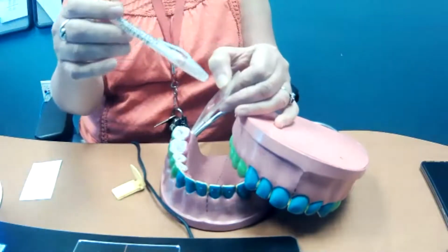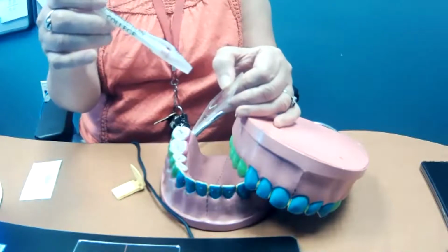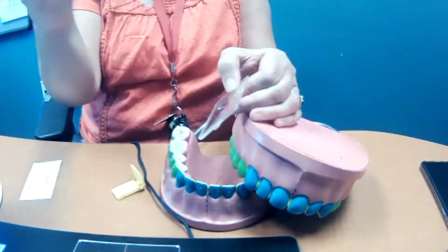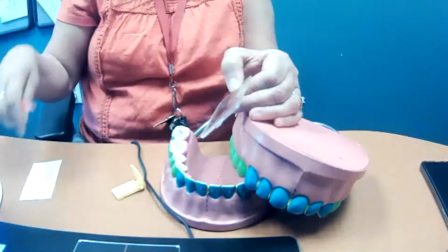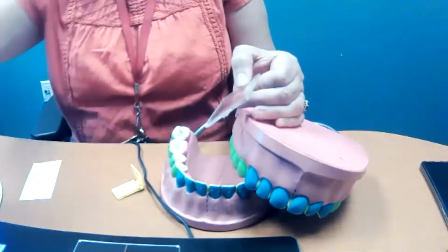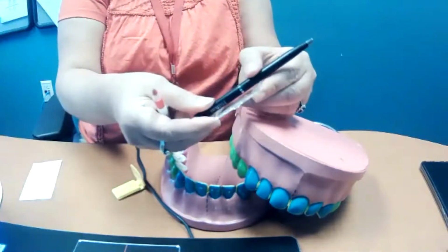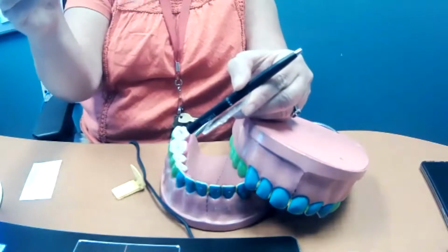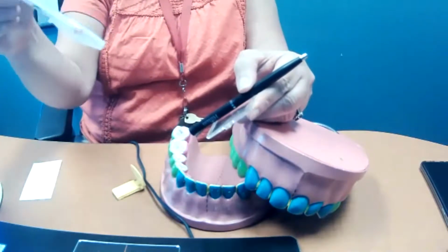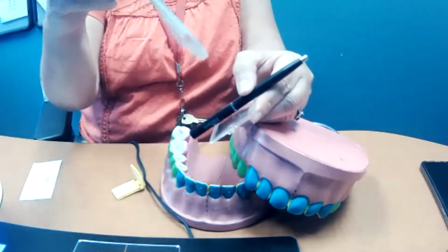In order to get, basically what they call a shadow image, because if we make believe that our X-ray beam is a flashlight and our tooth is on there, say our tooth is this pen, right? Actually, if we make believe that this is an X-ray beam, what we're really doing is getting a shadow image of our tooth on our film. That's what they kind of call it.